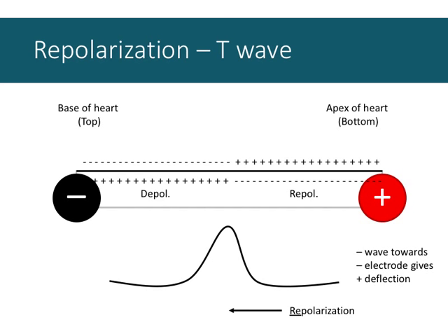Repolarization of the atria is what she was thinking of, that is lost while the ventricles are depolarizing. That is a disruptive, large signal where any other small electrical activity is overshadowed and lost in the noise.